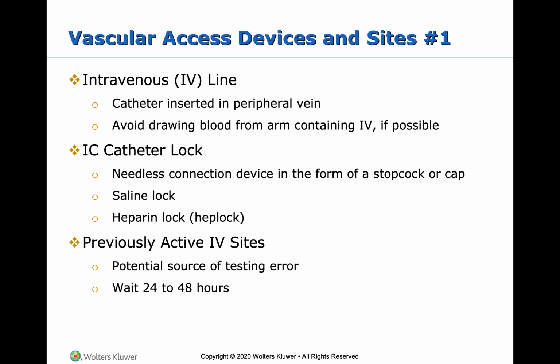Not only that, but if we shut an IV off, it's going to start beeping, and the nurse is going to come in right behind us and turn it back on if they are unaware that we turned it off for the blood draw. A lot of times what we'll do is have the nurse shut that IV off, and then we'll go draw another patient or two before we come back. That way we're not just standing in the room wasting time when we could be drawing other patients. And then we'll come back around and draw them after the 5 minutes is up.